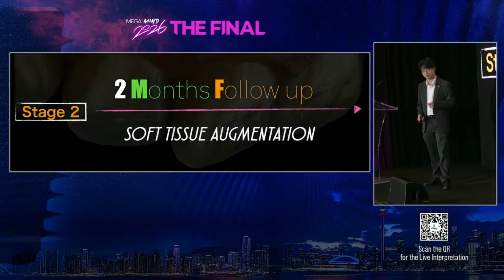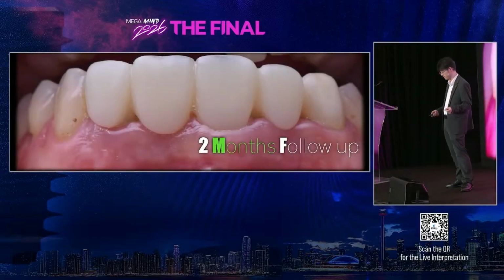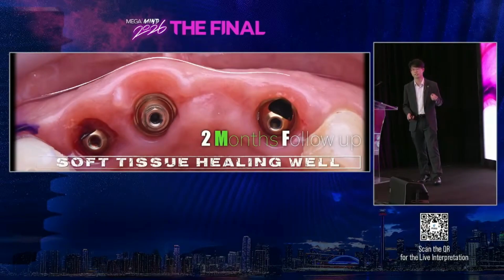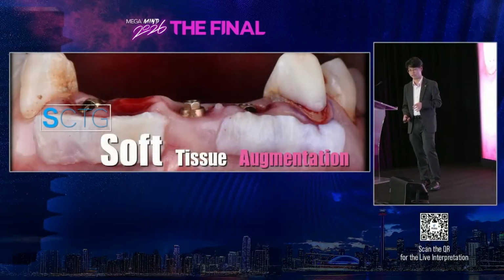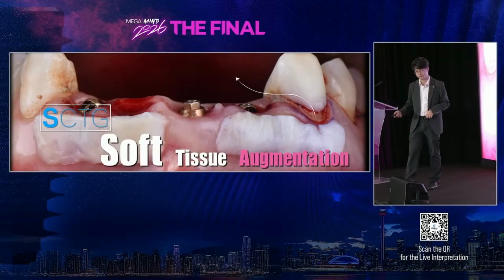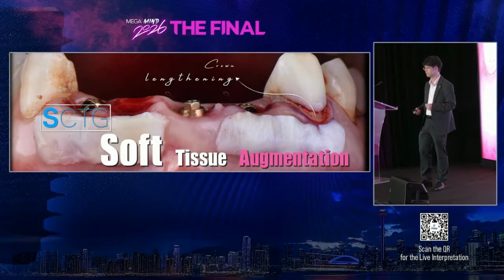And 2 months follow-up, the soft tissue augmentation. And this is 2 months follow-up. And soft tissue was healing well, but the contour has a little depression. So we use CTG to do the soft tissue augmentation on both sides. On the right canine, we did the crown lengthening because we need to balance the gingival margin on both sides.